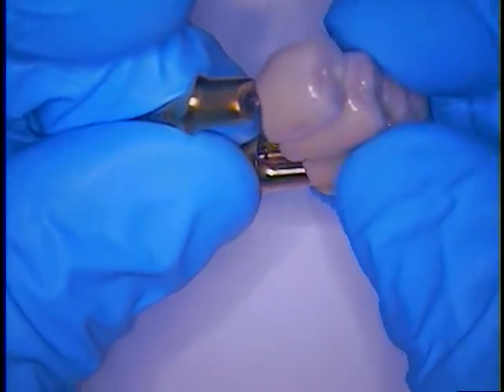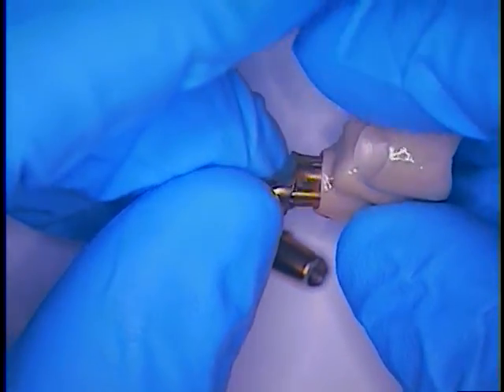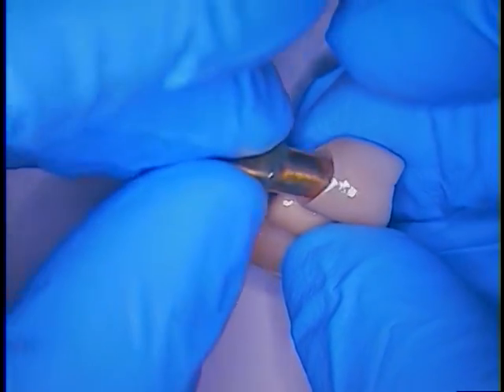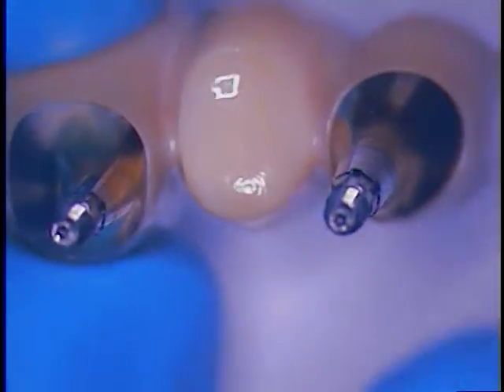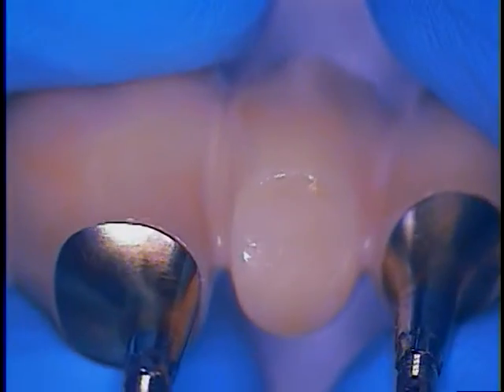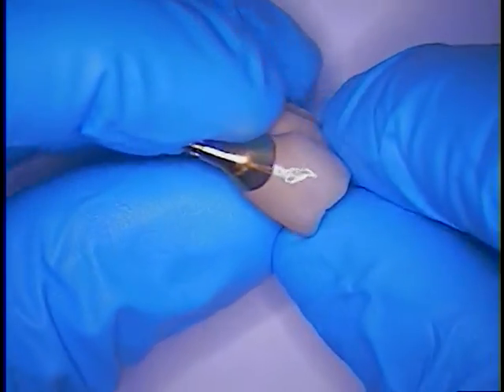This bridge today will also be screw retained, so I'm going to be filming the actual technique of cementing this all together so it becomes a screw-retained case. This is the underside — I've already ground the pontic area on the tissue model so that we have good positive contact and a nice smooth pontic, not exactly ovate as much as I want it to be, but certainly it's going to be functionally well.